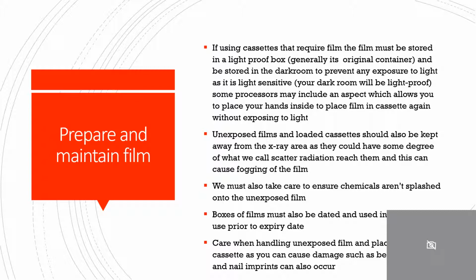We must also take care to ensure that chemicals aren't splashed onto the unexposed film, and boxes of films must also be dated and used in date order to use prior to expiry date. And we should take care when handling unexposed film and placing into the cassette, as you can cause damage such as bending, and finger and nail imprints can also occur.